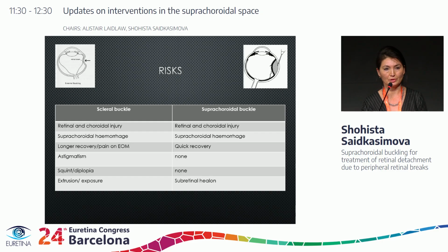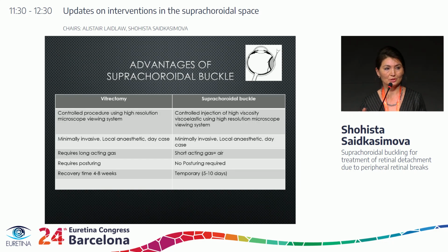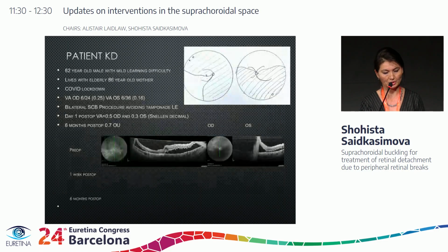There's a risk of cutting too deep, cutting the vessels, creating retinal hemorrhage, choroidal hemorrhage. But because these are very anterior vessels, they're not venous, they're not arterial vessels. If the choroid does bleed, then a little bit of pressure will stop the hemorrhage. Unless you go to 3 and 9 o'clock and cut the long ciliary arteries, which of course will produce a very rapid, strong, fast bleed.